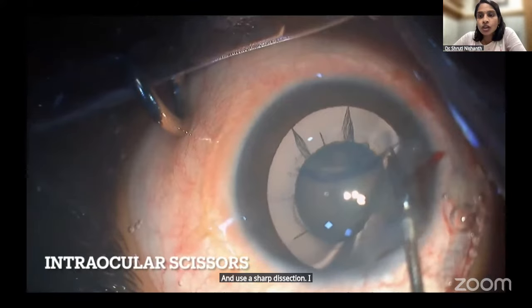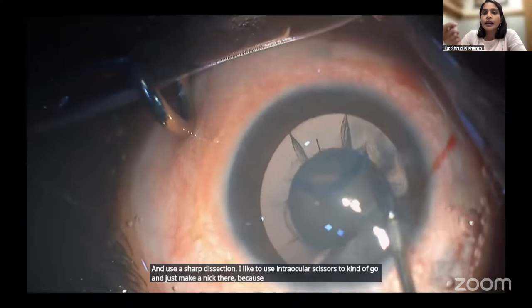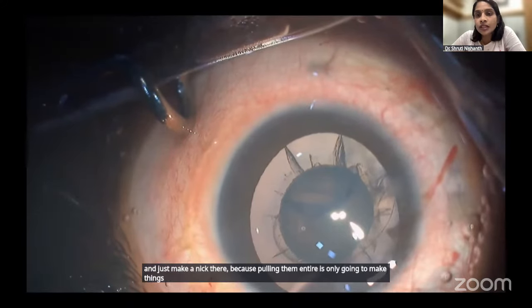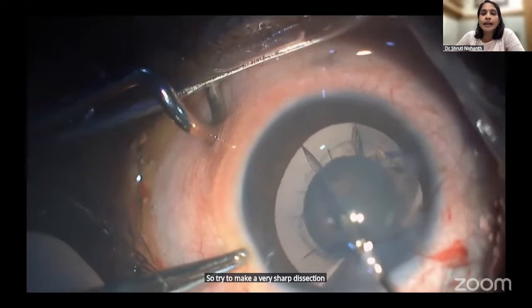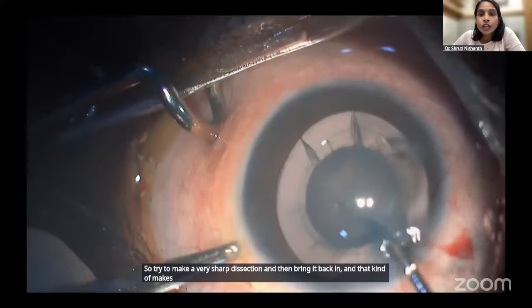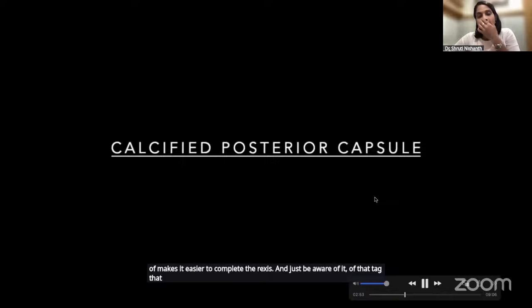I like to use intraocular scissors to just make a nick there, because pulling on it is only going to make things worse in pediatric capsules. So try to make a very sharp dissection and then bring it back in, and that makes it easier to complete the rhexis. And just be aware of that tag that you have there for the rest of the surgery.